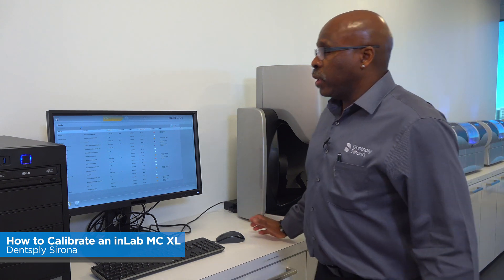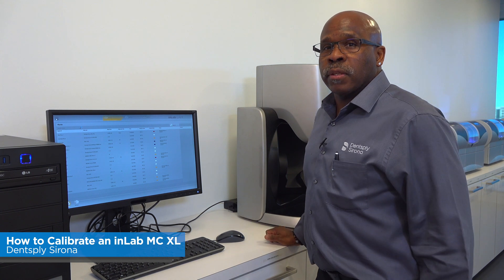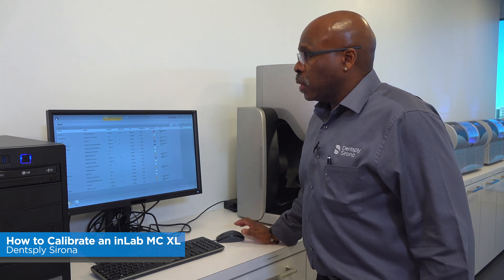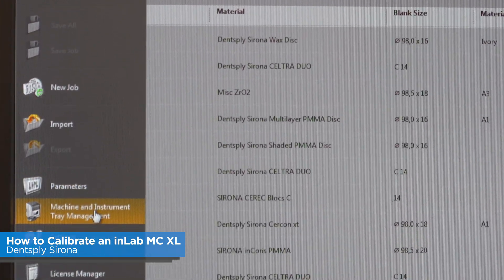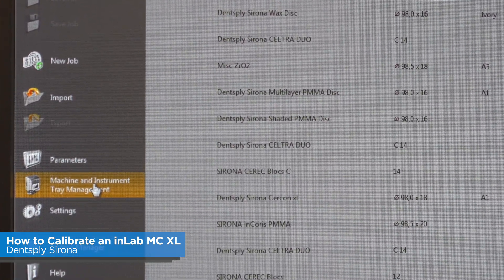The first thing we need is to have your inLab CAM software open. Make sure that you have your inLab milling unit turned on. Then down the menu bar, you're going to open up and go to Machine Instruments and Tray Management.